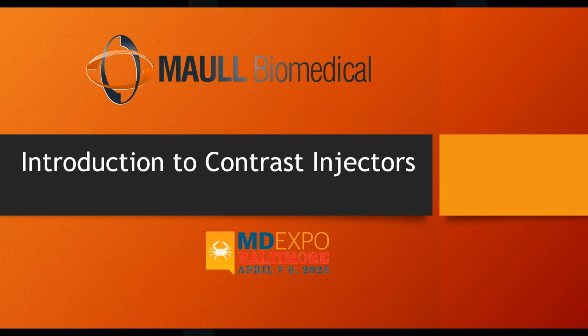So some X-rays get absorbed, but the X-rays that get through are strong enough to strike the plate and turn those parts of the image dark. Okay. Now, for a good X-ray image, you have to have some of both.